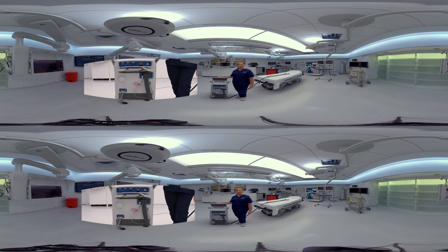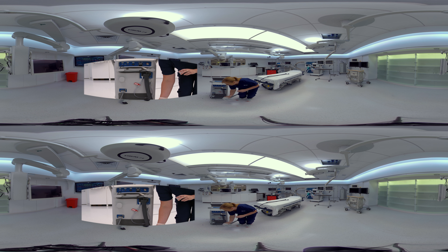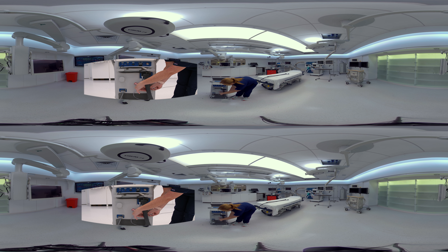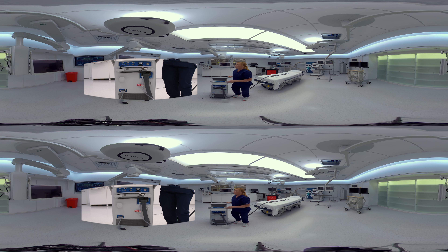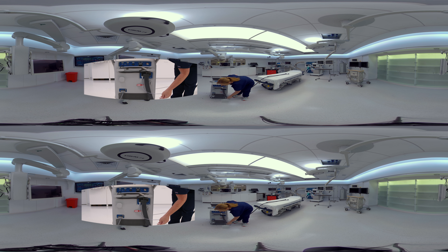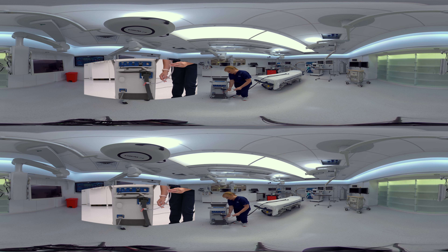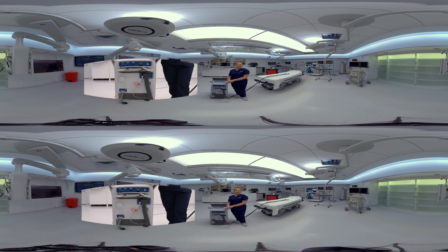This is the fill tube. If you get an alarm that says your reservoir is low, you can go ahead and click the fill reservoir button on the main screen. Then you're going to grab a couple liters of sterile water, open it up and place it on the ground. You can remove this tube from its parking spot and drop it into the bottle of water. You will click start on the screen and the Arctic Sun will suck up all the water that it needs. Once that process is finished, you're going to remove the tube from the water and click start again — it will suck all the water out of the straw, and then you can replace it where you found it and resume therapy as normal.